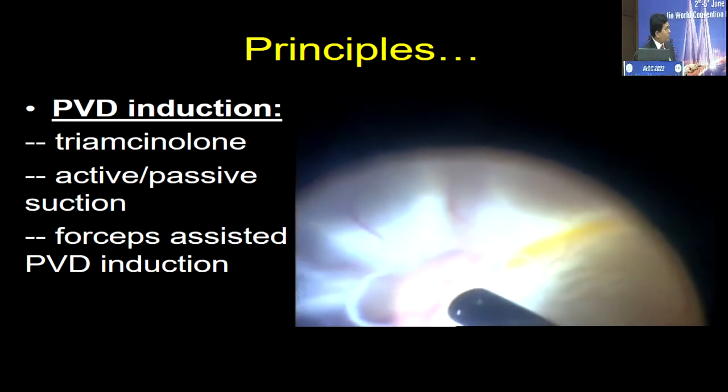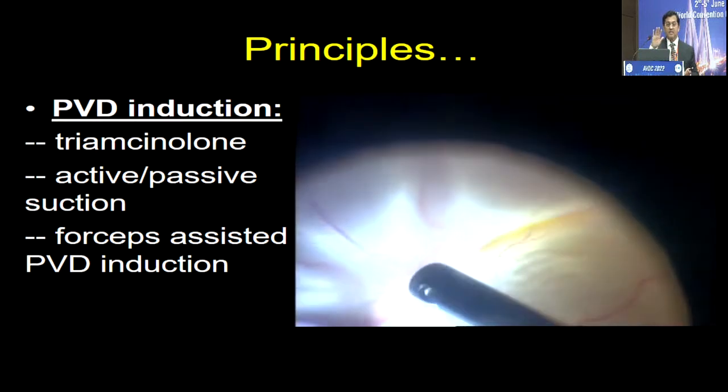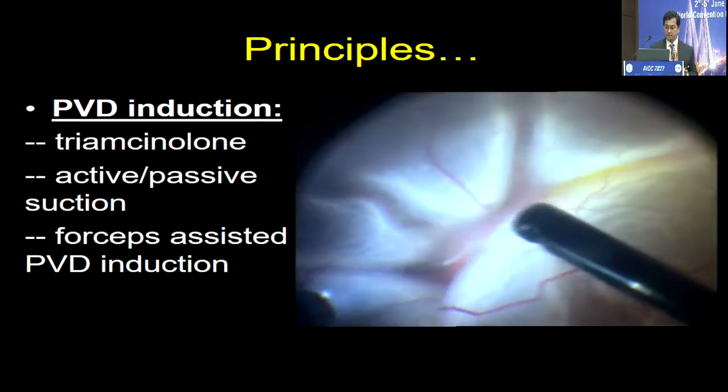Another thing you can use when you're doing this maneuver is put a small bubble of PFCL on the posterior pole of the disc. So it acts as a third surgical hand, and you can do this same vitrectomy or core vitrectomy to start with.